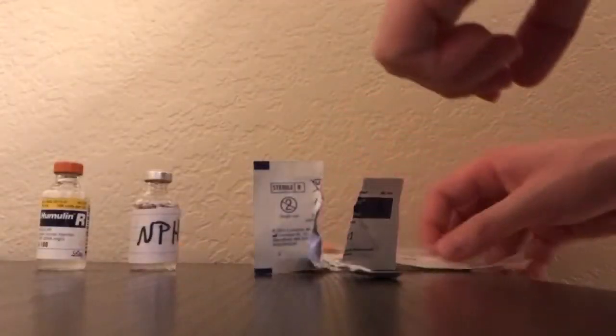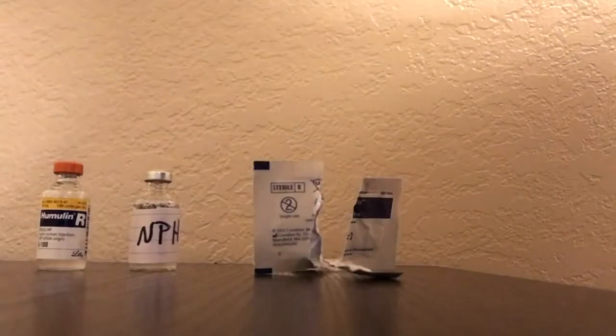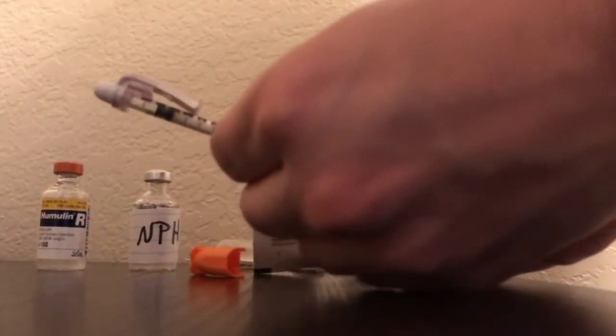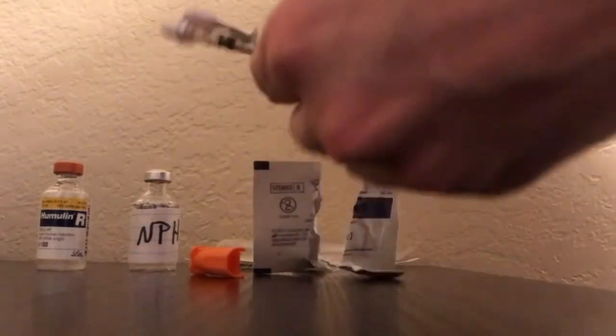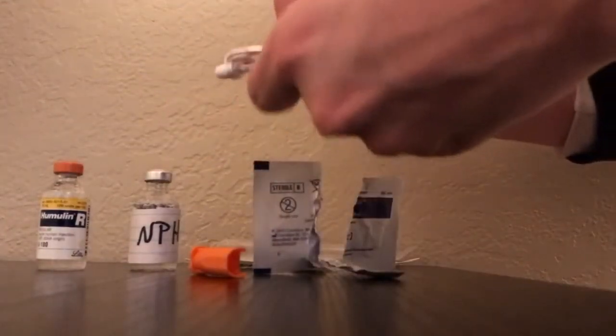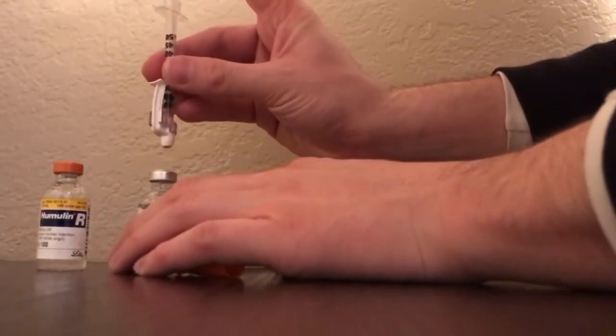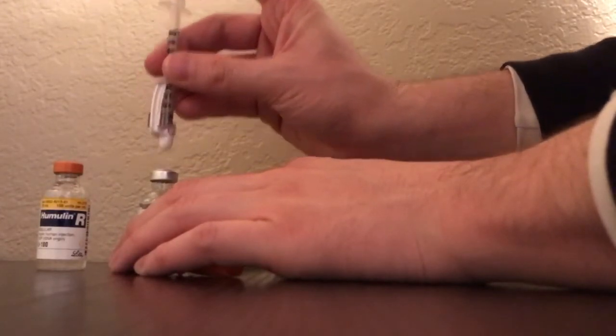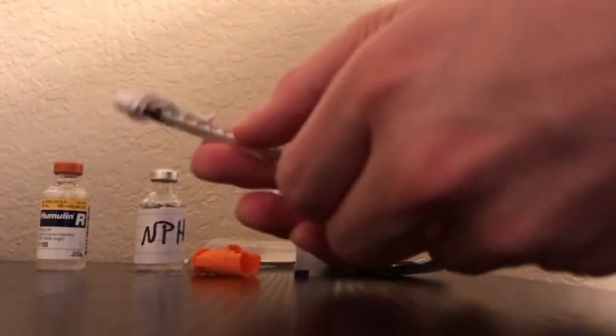Grab your syringe and open it up. We're going to do 10 units. Take 10 units of air, only air, and place it into the cloudy NPH solution. Make sure you get a firm grip, inject that 10 units of air, and then take it out.